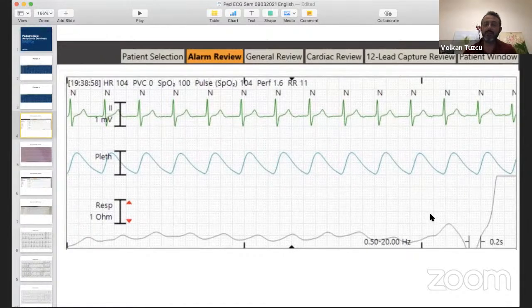Okay. So junctional rhythm, because it really looks narrow, right? Really not wide this time. There's no question for a 16-year-old. This is not a wide QRS. Any other possibility other than junctional rhythm? Okay, junctional rhythm. What type? Because it's a little fast, right? 104, so it's accelerated junction. That will be your first bet.